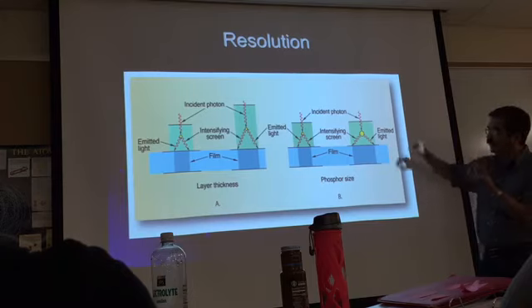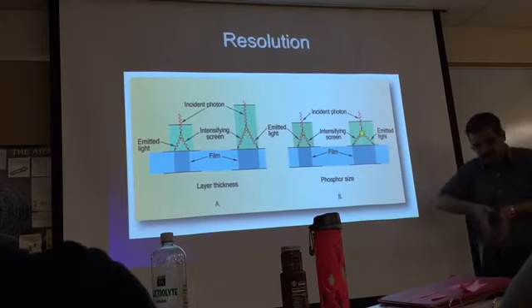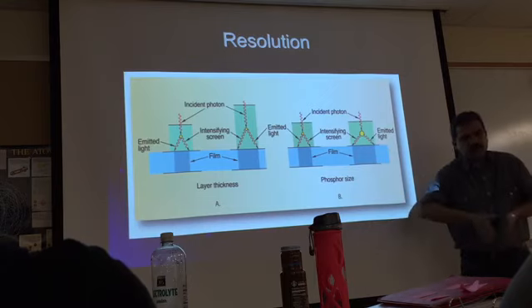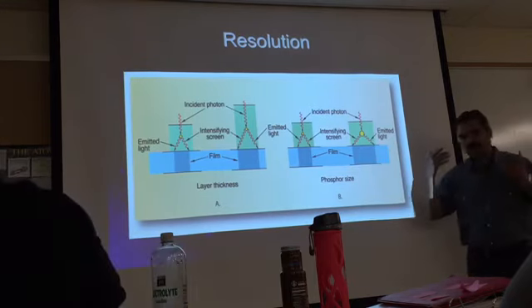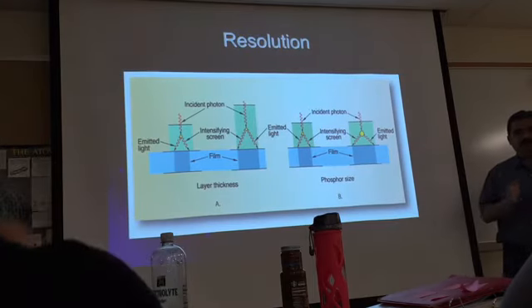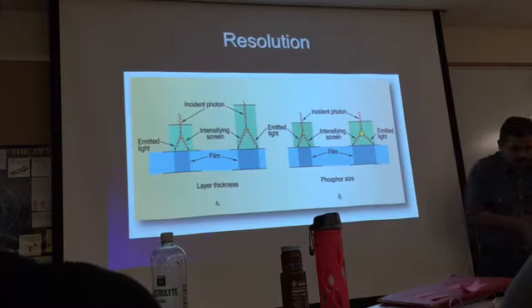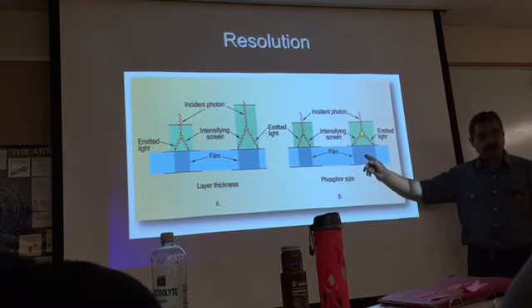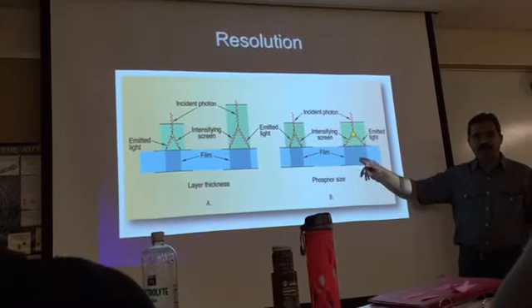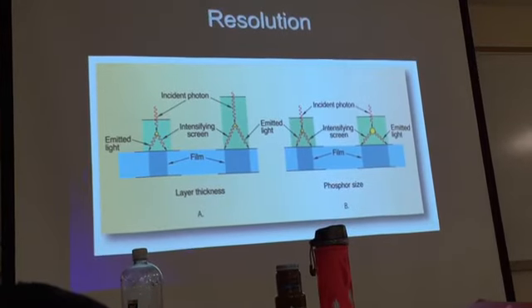The problem with that is that when you look at the geometry, because it's bigger, it's going to stretch the light even more. Okay? So that's just a term that I'm using, but what you're doing, light is being created isotropically, and so it's being expanded over a wider area. And when you have a wider area in the film, that will give you less resolution.